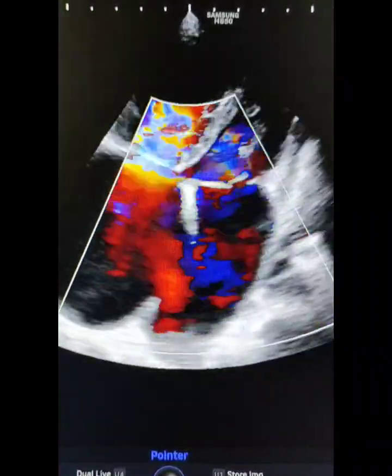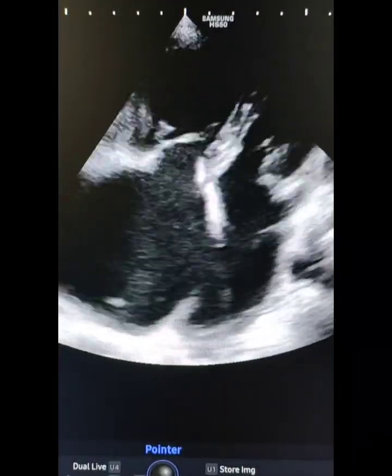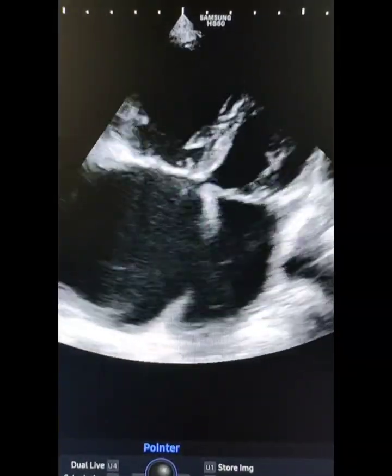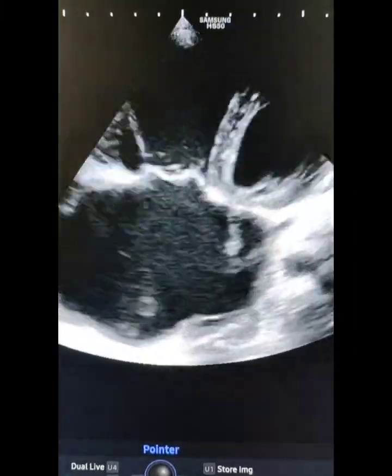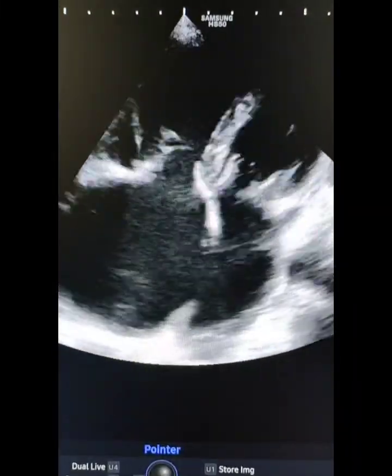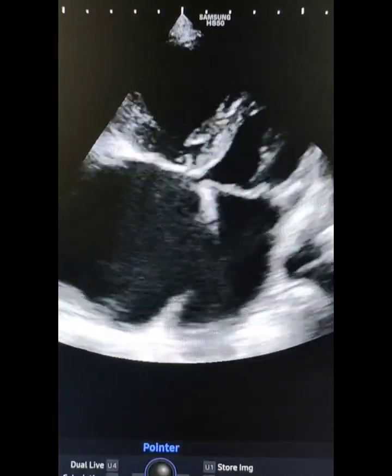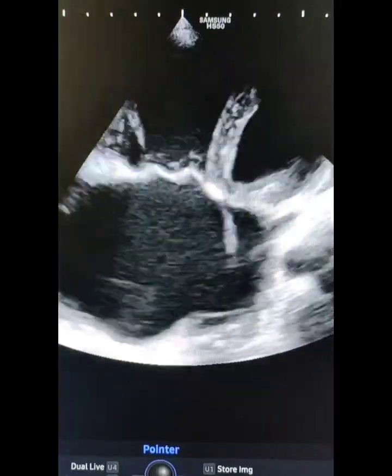In this 40 years of age, she has presented this. So all the rims, you can see all the rims were adequate, but the thing is the patient was at 40 years of age, with this severe pulmonary arterial hypertension with the severe RVH and everything. Still the flow is left to right, but the possibility of closure of this ASD is very less.